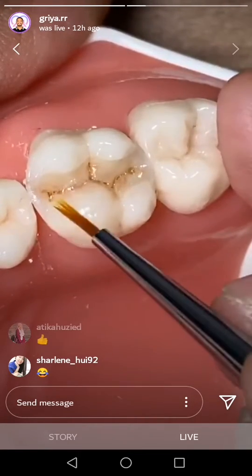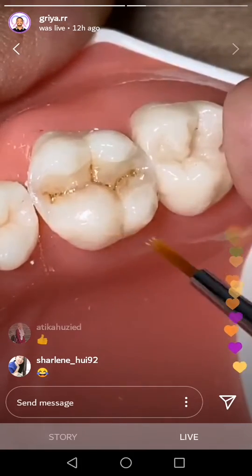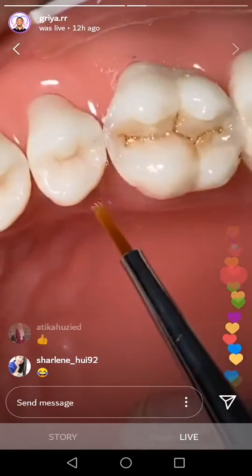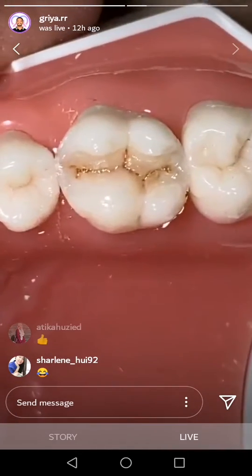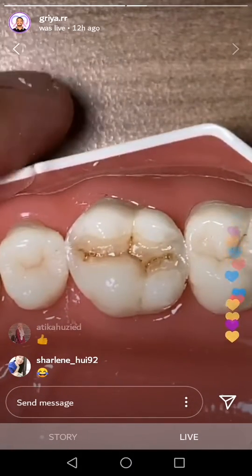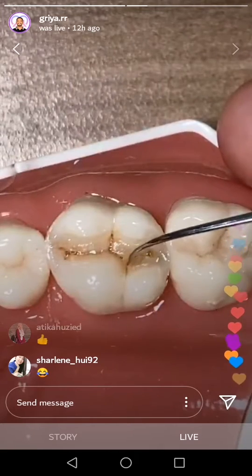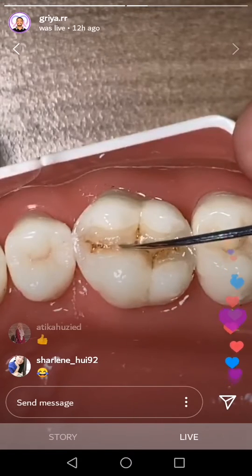How about the anatomy? Do you like secondary anatomy? Bulky anatomy, or complicated, or muscle anatomy? It depends on your style. For me, I love simple anatomy. Simple means you can make it fast, and then you can get the aesthetic. Make sure.